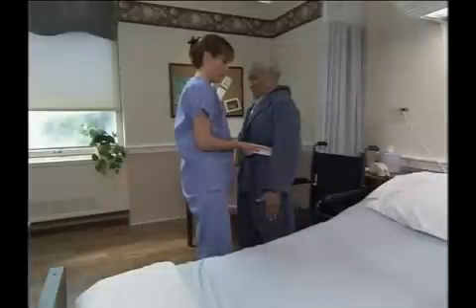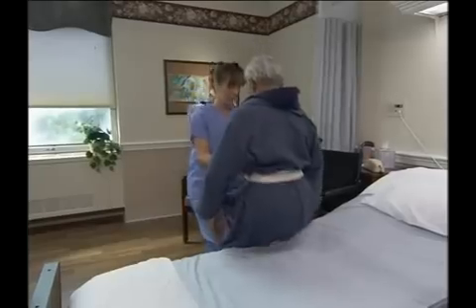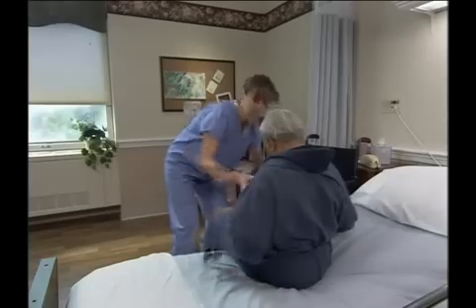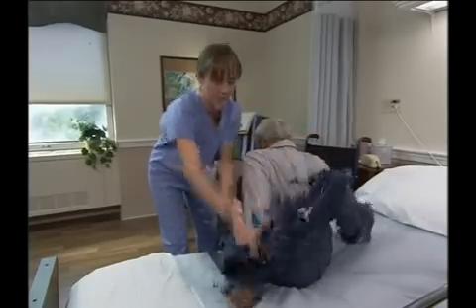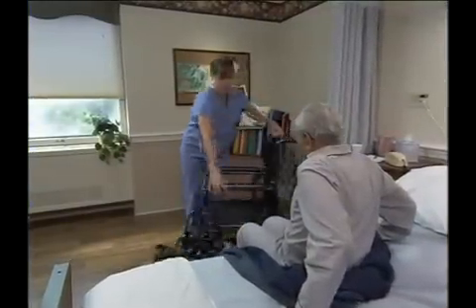Slowly help the person to turn toward the bed by pivoting on his strong leg. Then, help the person to sit on the edge of the bed. Now, remove the transfer belt. Remove the person's robe if appropriate. Then his slippers. Next, move the wheelchair out of the way.